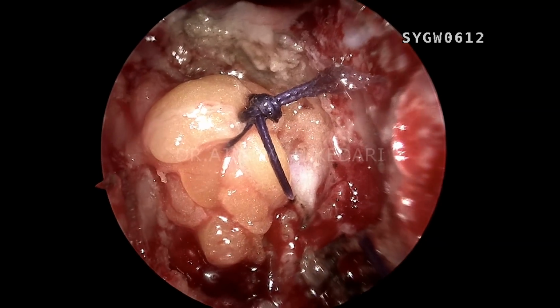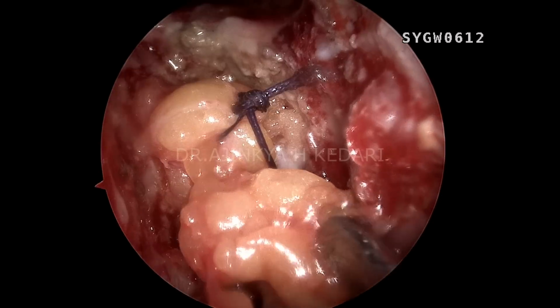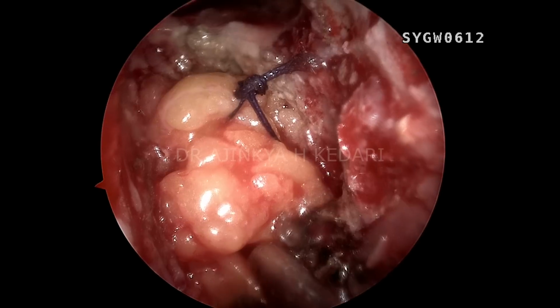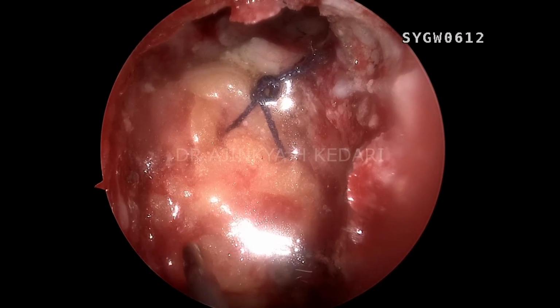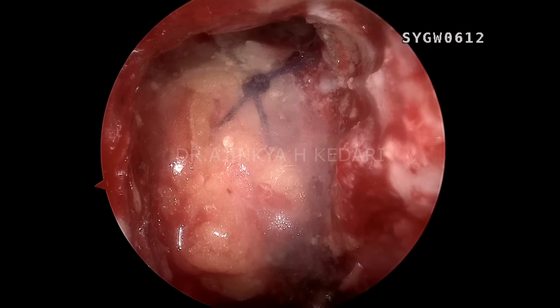As you can see, it's a vicryl, an absorbable suture. You can see there is no CSF leak anymore. You can see slight pulsation, but that's quite natural. One more plug of fat, making sure that you have a tough seal inside. Now you can see there's no CSF pouring out. You can see that's the tissue glue I'm putting in, making sure I keep the frontal sinus patent.